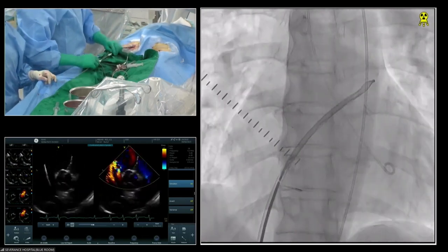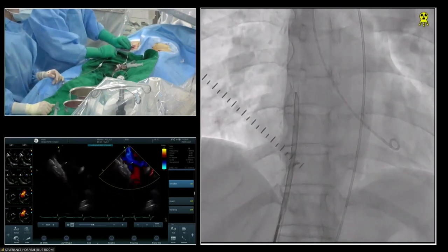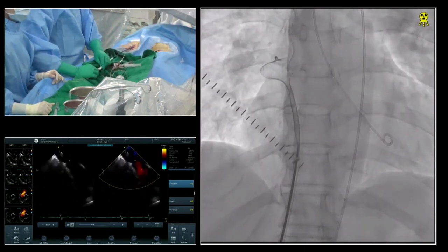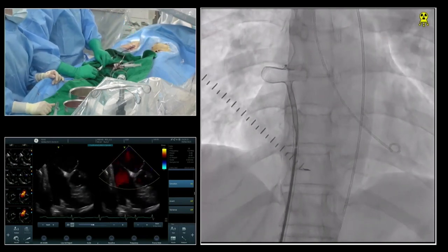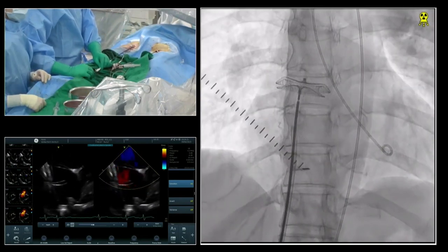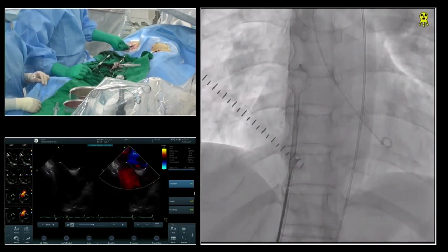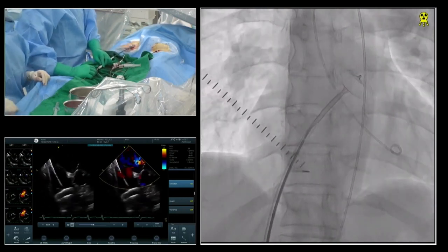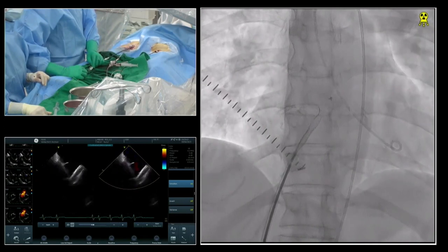Or a little bigger. Actually, my policy is to put in as small a device as possible, so sometimes I change the device size. The Korean health insurance company covers it if I use a different size. The patient should have the device lifelong, so I think if possible, a smaller device maybe carries less risk of long-term thrombosis or something.